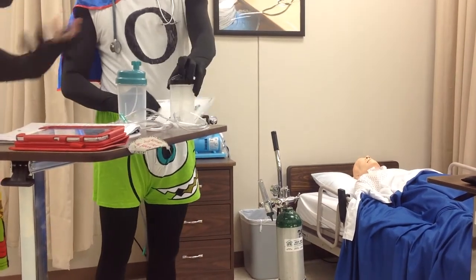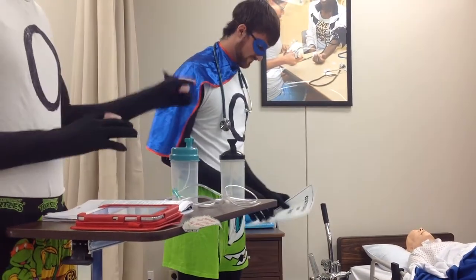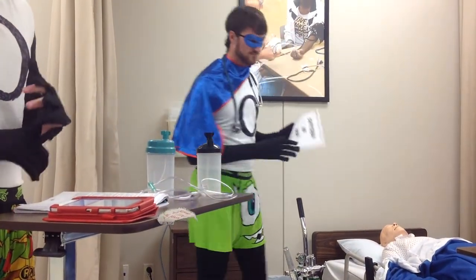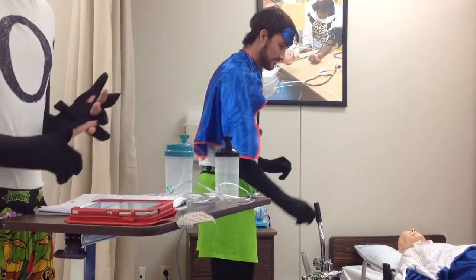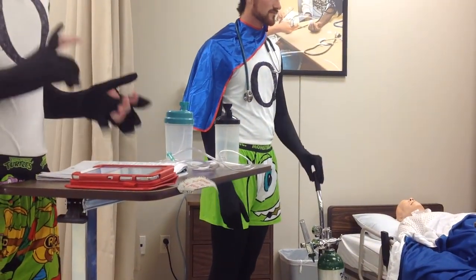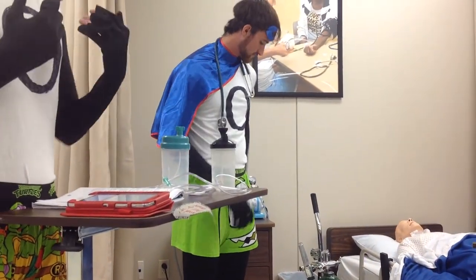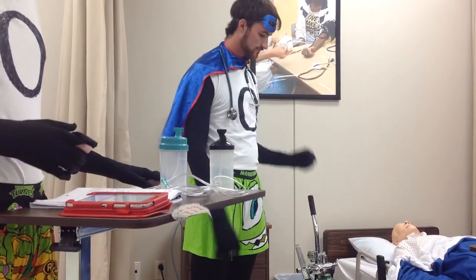You're going to get your patient's info from the label and make sure you have the right room. The first thing you're going to do is put your fire hazard sign on the door. You're also going to put one at the foot of the bed when you go inside. The reason is that oxygen is one of the 3 main pieces of a fire. If you smoke while on oxygen and inhale an ember, it can start a fire. If you have your nasal cannula on and you're smoking and you breathe in an ember, you can char the entire inside of your airway. So we've got to have our warning signs up.